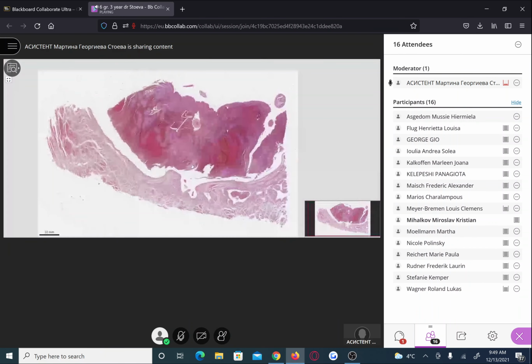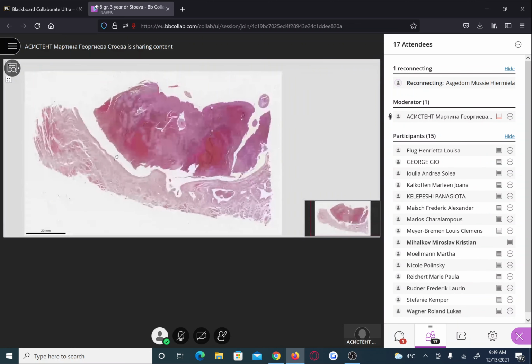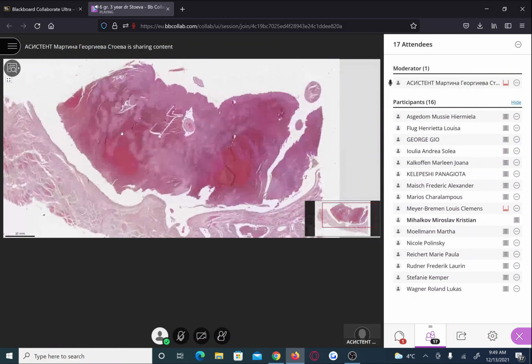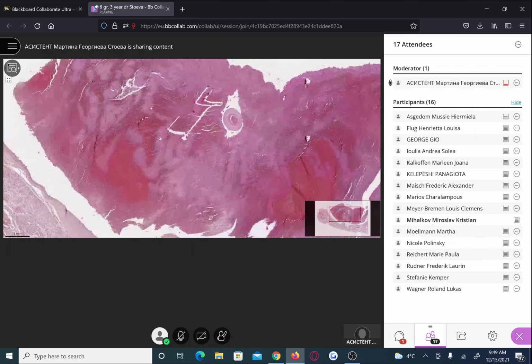After we recognize the organ, this is the heart, we can find that in the cavity there is something wrong, something that shouldn't be here, and it is exactly a thrombus. Even at low magnification, we can find some alternating zones. Some of them are paler compared to the adjacent ones that are reddish in color.